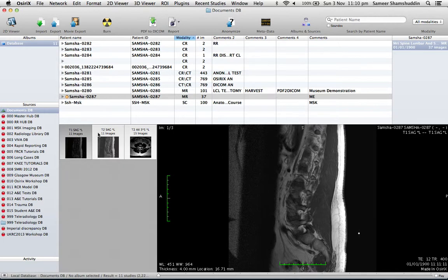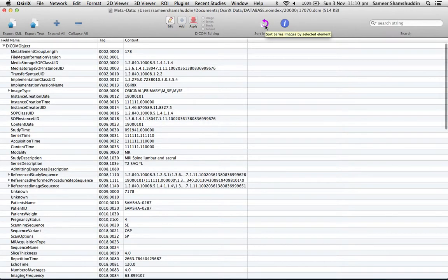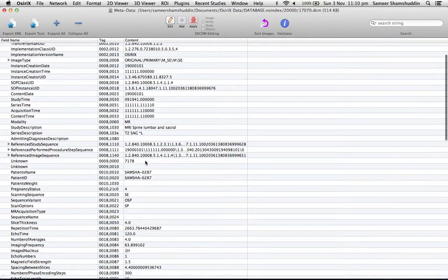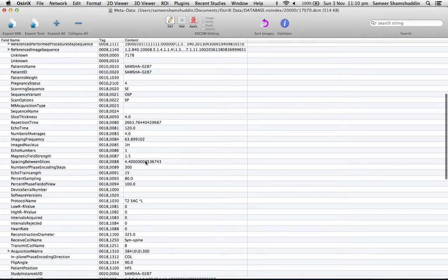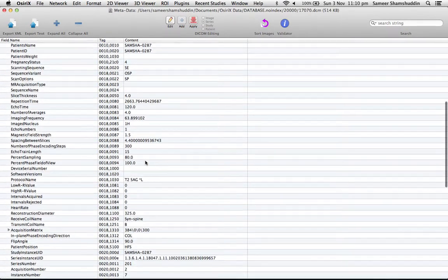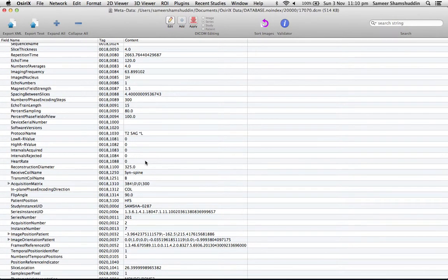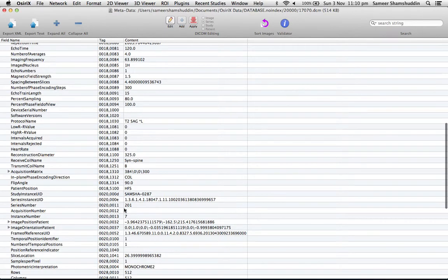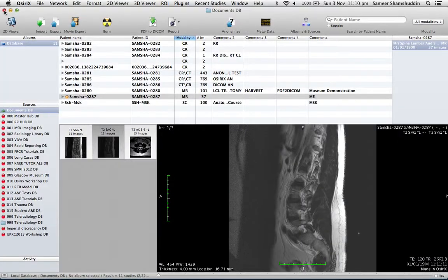You can actually, if you look at the metadata of T2 sagittal, that will have a number which is slightly different from 301. So series number is 201 in this patient. That's the second series. So by changing the series number, you should be able to change the position of the series in the database screen.